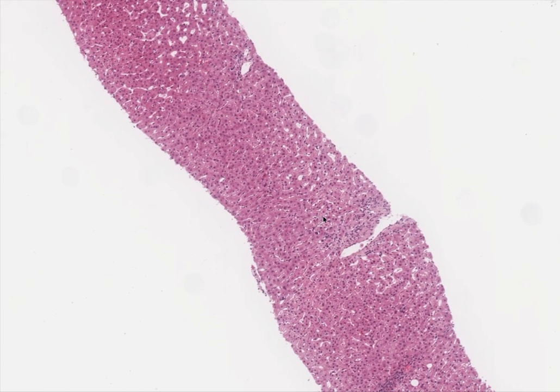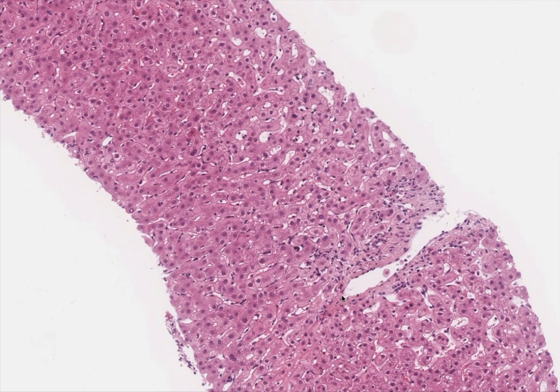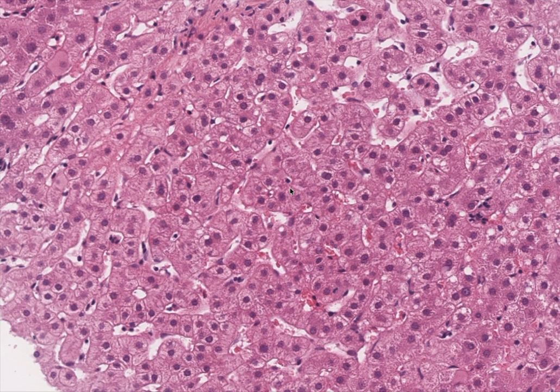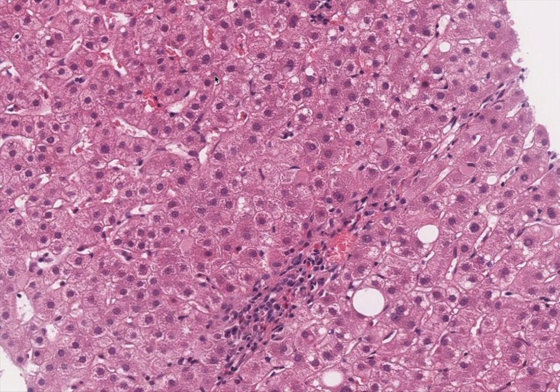There doesn't appear to be much fibrosis around the vessels here. This vessel looks normal. Let's have a look at the parenchyma to see what clues we can find. So as we look around, we can see that there isn't much fat in the liver, and that most of the cells here are still alive. There's no advanced spotty necrosis.